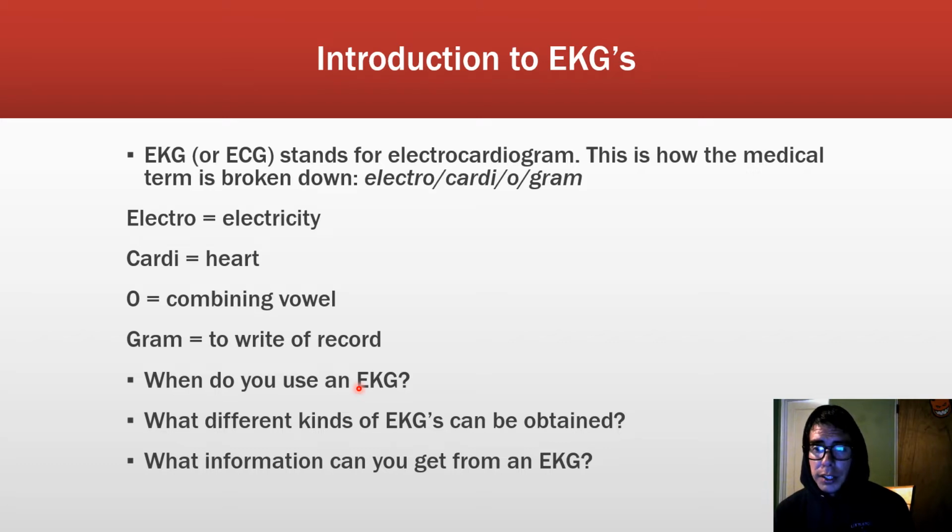There's lots of things you can identify. Those are just the main things, but we'll talk about those more either later in this video or in the advanced one, the advanced EKG interpretation thing that I'm going to do.